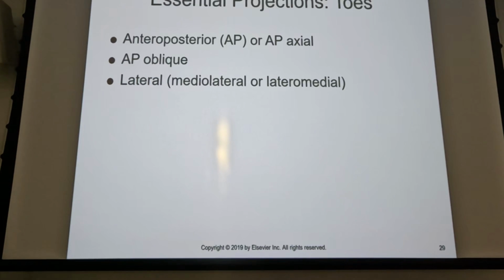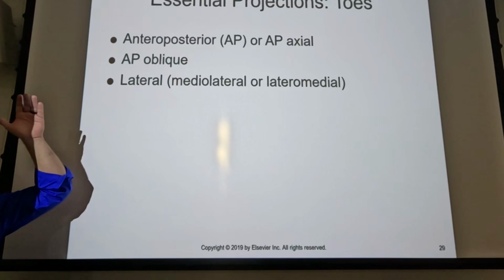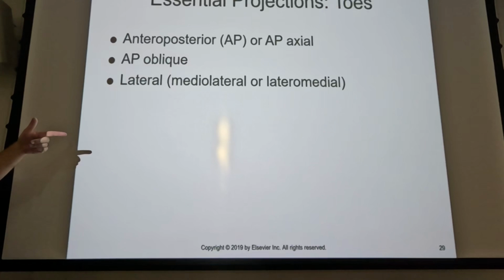So those are our most common, are going to be AP, and it's really AP axial. So just kind of mentally scratch AP and understand that in clinicals you're going to be doing AP axial. Same thing for the foot. In your textbook, it does the same thing, but it's going to be AP axial.